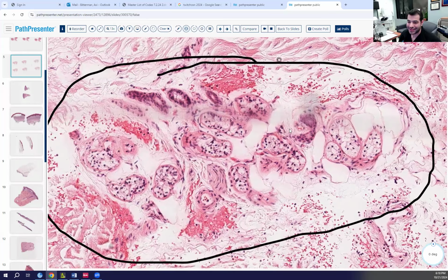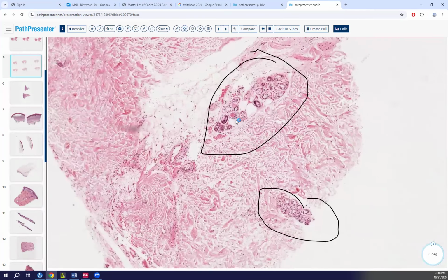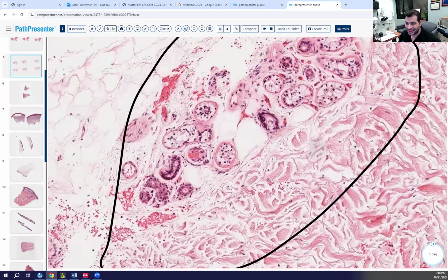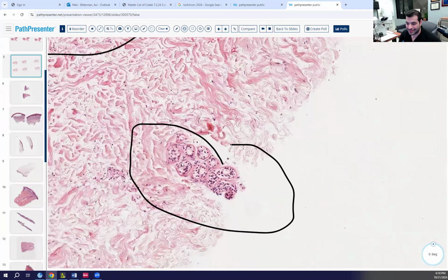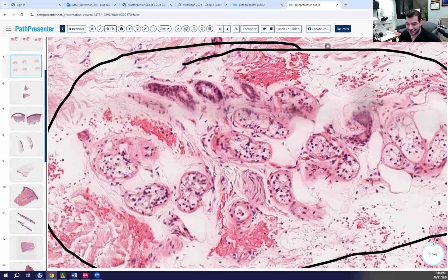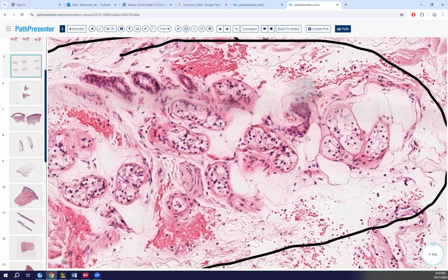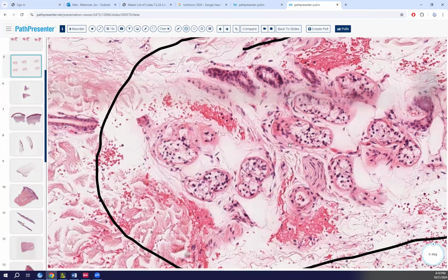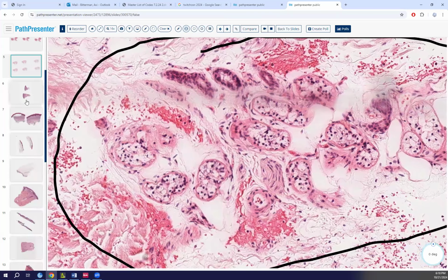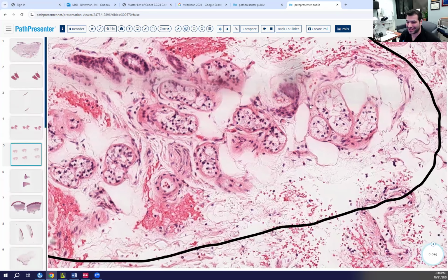Do you see change reflecting that, and where do you see it? Like necrosis of the sweat glands. Yes. Do these sweat glands look normal? No, they don't have the round hole in them, they don't have a lumen. They look terrible. These are clearly not normal eccrine glands.